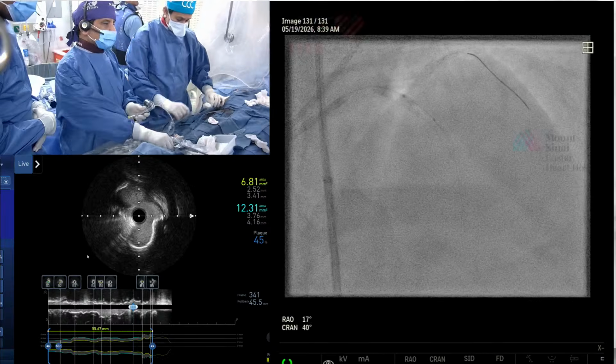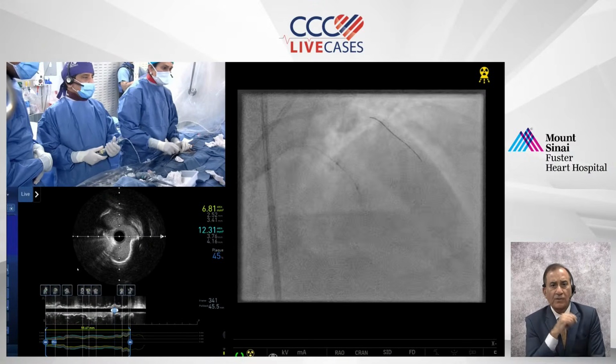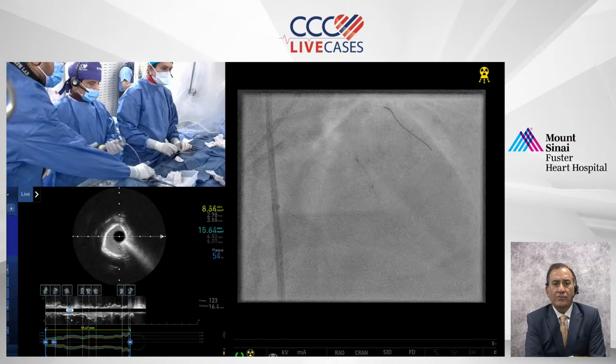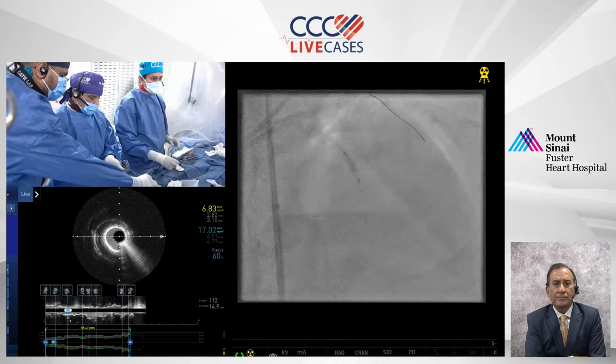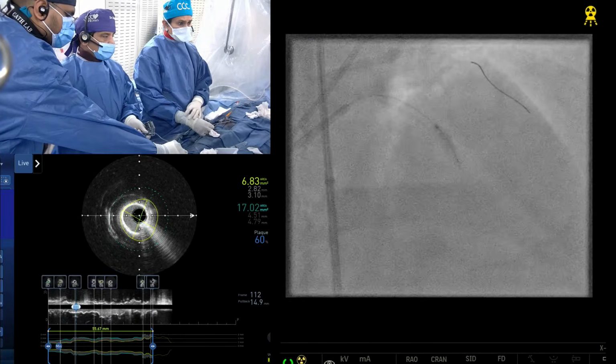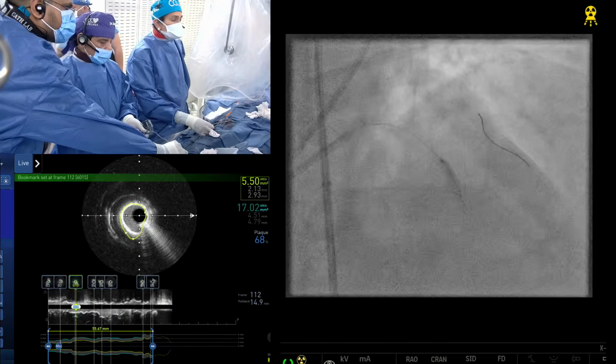Now here, would you go even a little more distally? Yeah, we are sure, because we are going to put a stent in all this calcific area. Okay, good. Here we go. This is the advantage of this Aero, where you can go again to atmosphere 3. I think we are good. After this, we can come out. But do one more at this place. You have to remember that question always comes: it's not a lot of calcium in the distal.